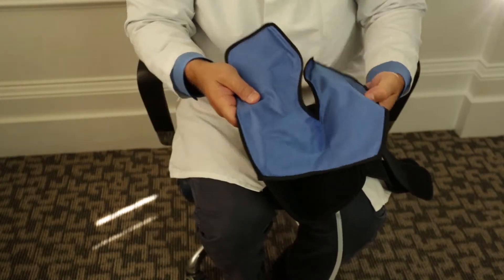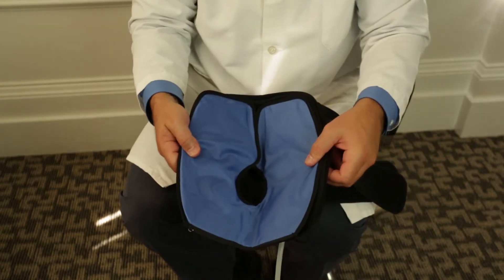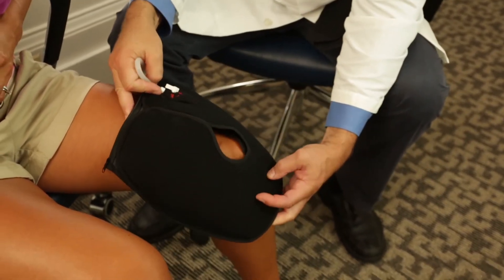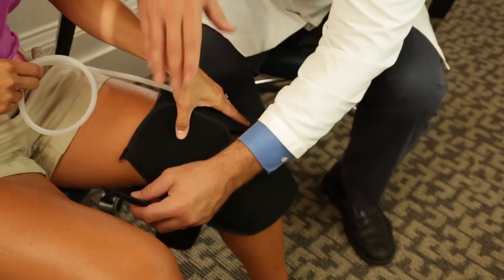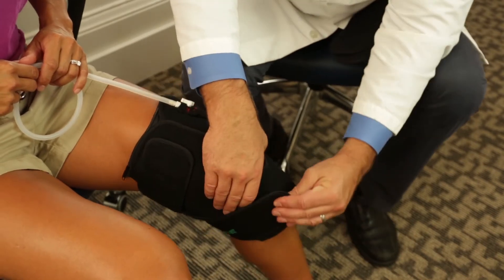It's easy to use, too. Once you've frozen the gel pack for at least two hours, you'll place the gel pack into the brace, making sure the seams line up over the kneecap. Grasp the knee splint and locate the valve on top. Place the opening over the affected kneecap and secure the two compression straps to desired fit.